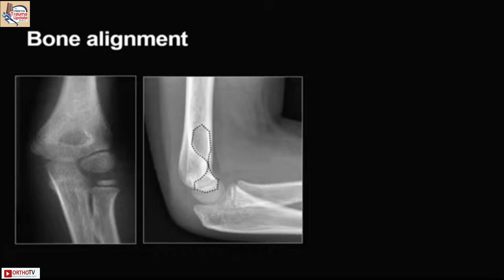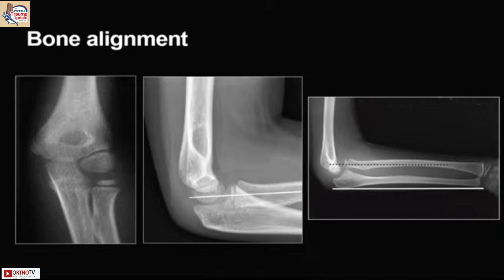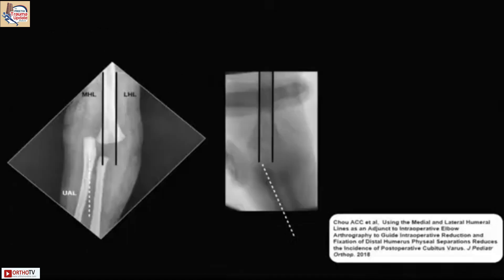Look for the teardrop — whether it's nicely formed or shows any change — and then look for the radiocapitular line. Also look for something called the coronoid line, which is similar to the Shenton line in the hip. It runs continuously with the proximal volar coronoid and with the anterior humeral line as a smooth curve. If you see any change, there is probably a dislocation or something else going on. Also look at the ulnar bow as described by Mubarak — it should be touching dorsally from distal to proximal.